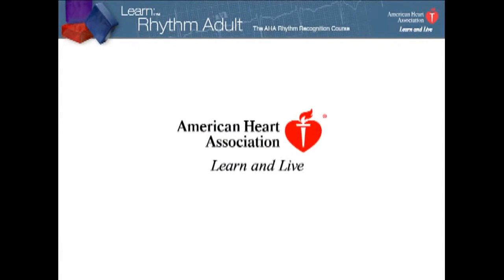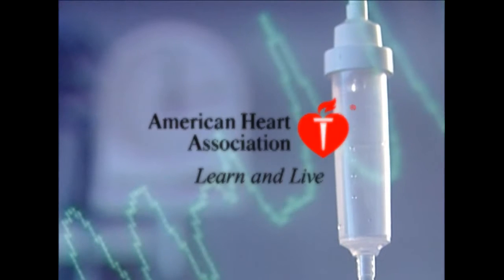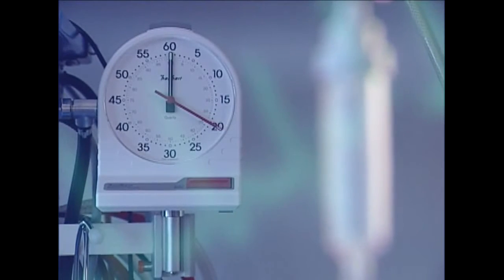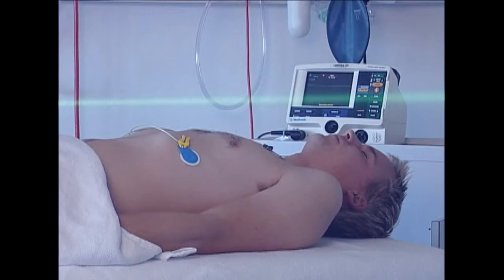Welcome to the American Heart Association's Learn Rhythm Adult, an official online AHA rhythm recognition course. The Learn Rhythm Adult program teaches all you need to know about rhythm recognition within the standard Lead 2 monitoring system aimed at treating adults with arrhythmia.